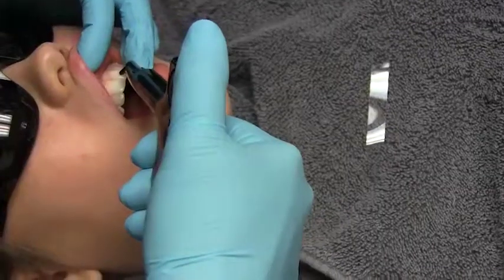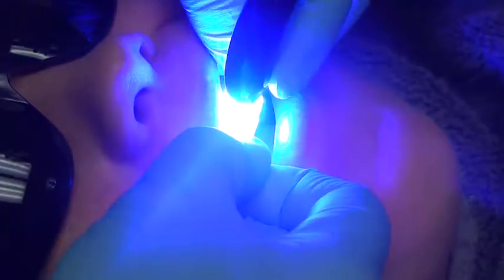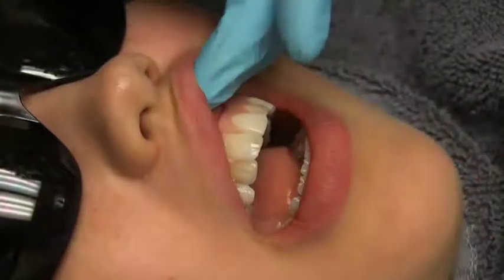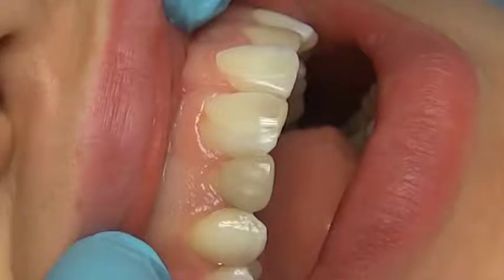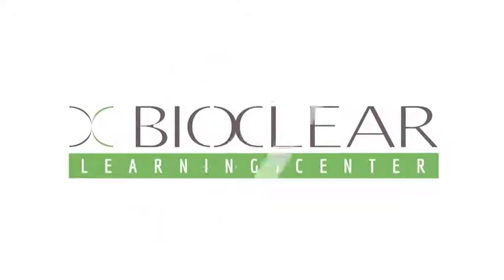So what I'm doing here is placing a little stream of composite, and then I've taken a piece of mylar on top of that, pressed it down, and cured it. And so what I've done now is essentially created a little swatch of composite that has a mylar finish, which is going to be what my final polish is going to be with the restoration.